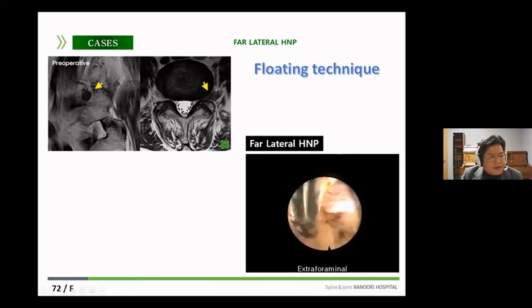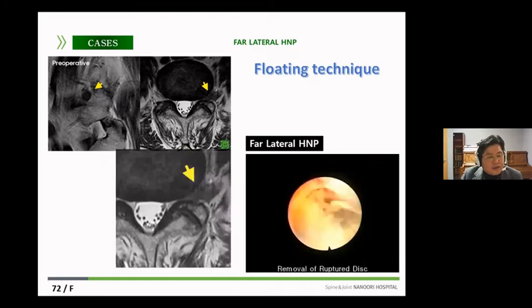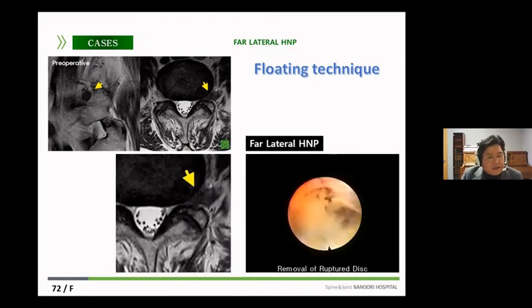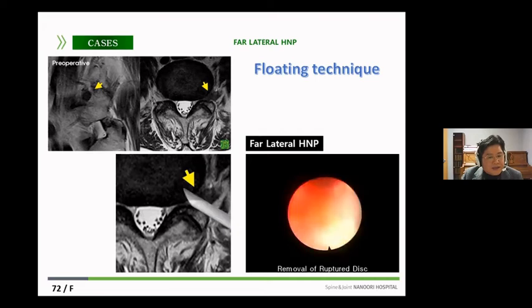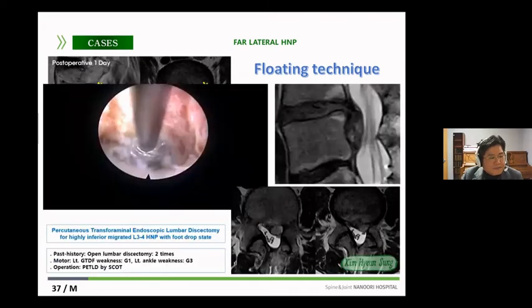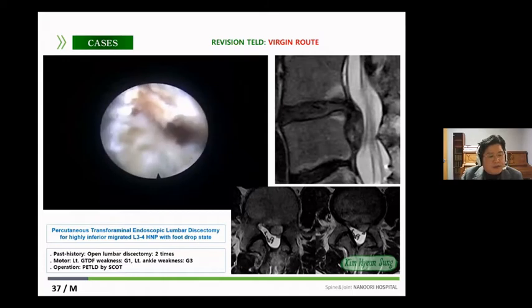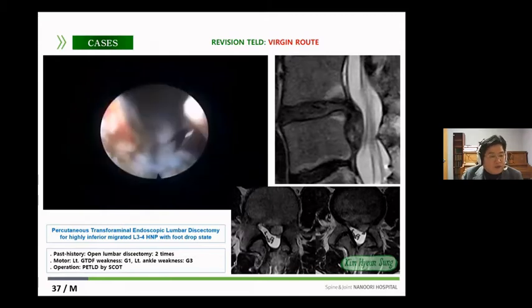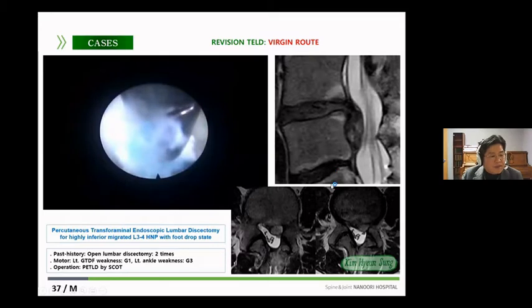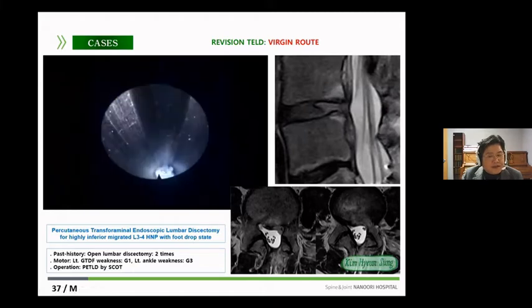If a large far-lateral disc rupture occurs, it is difficult to insert the working channel due to severe pain during insertion. Because of that, it can be effectively removed using the floating technique. In cases of recurrence after open lumbar discectomy, open surgery may lead to dural tears or neural damage due to adhesion. However, if we use the transforaminal lumbar discectomy, it can minimize this problem by using a fresh route independent of the existing scar tissue.